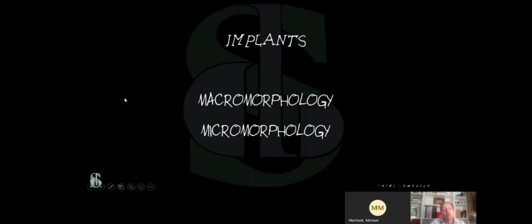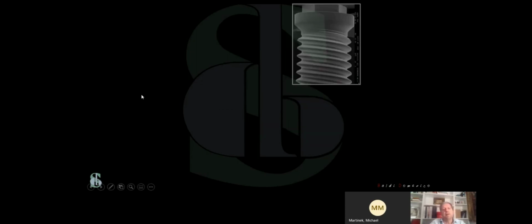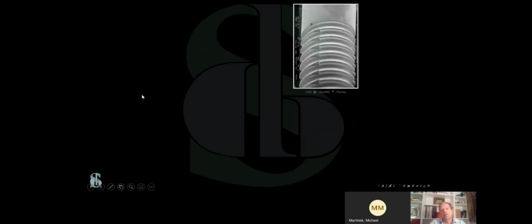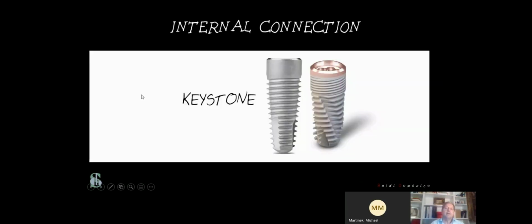Look here, it's possible to have an expansion of the bone, but we have to choose the best implant, because of course we have to know that implants are classified by macromorphology and micromorphology. If we speak of micromorphology, we have different kinds of surface, and we know the surface is very important in order to obtain secondary, biological stability. But the macro point of view is also very important. In the sinus lift, I suggest using a tapered implant with a good thread design.